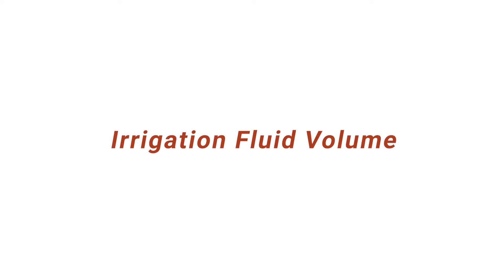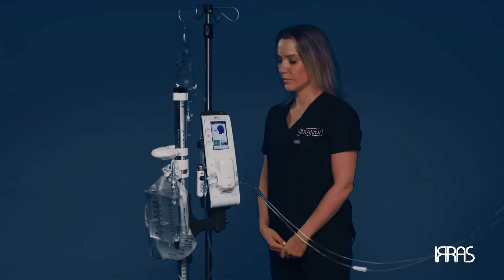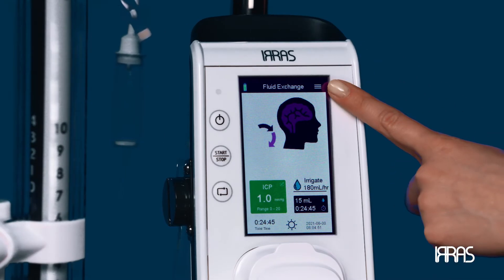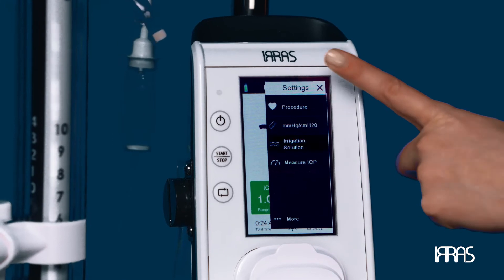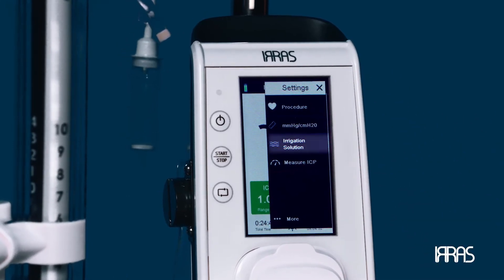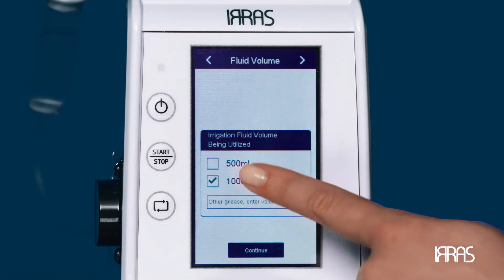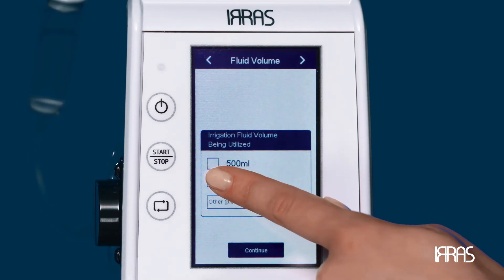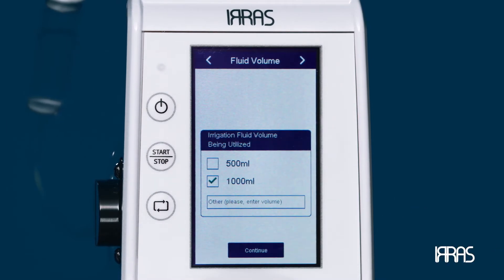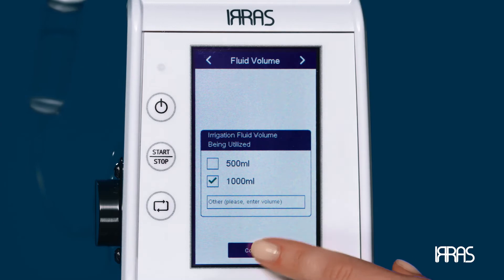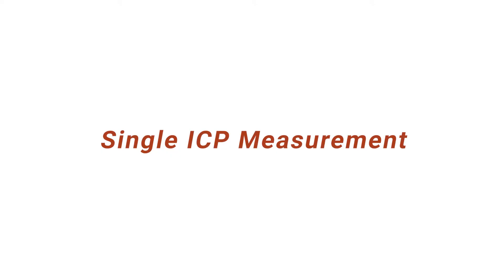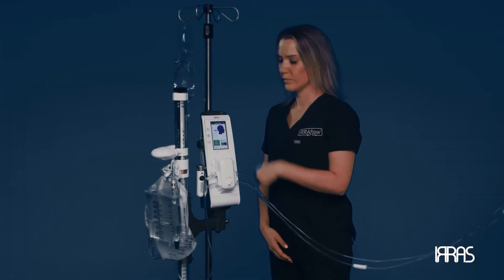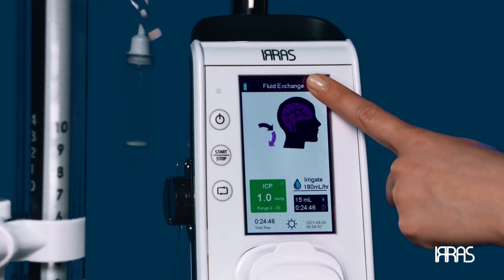Irrigation fluid volume — to adjust the volume of irrigation solution, go to the settings menu and choose your irrigation fluid volume from 500 milliliters, one liter, or another volume to be entered. Confirm you have selected the correct volume and press the continue button.